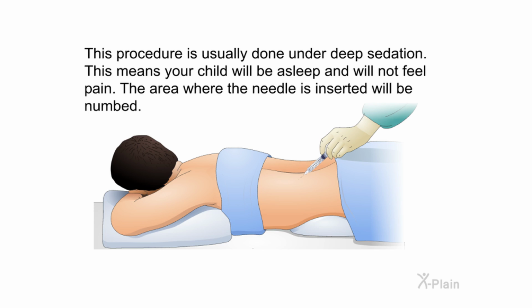This procedure is usually done under deep sedation. This means your child will be asleep and will not feel pain. The area where the needle is inserted will be numbed.